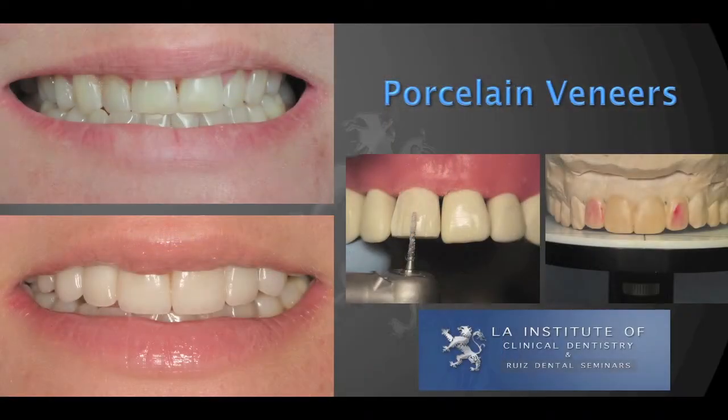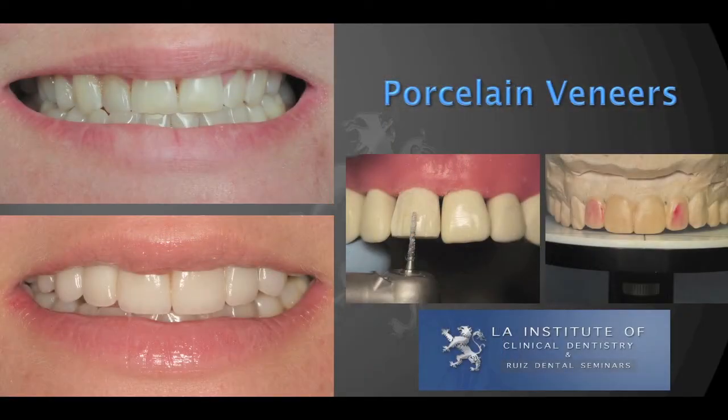The subject today is porcelain veneers, and I want to share with you a technique or an approach to overcome a complicated situation when we're doing porcelain veneers — patients who have a border-to-border or a cross bite.